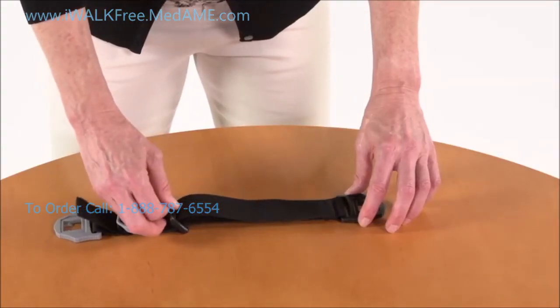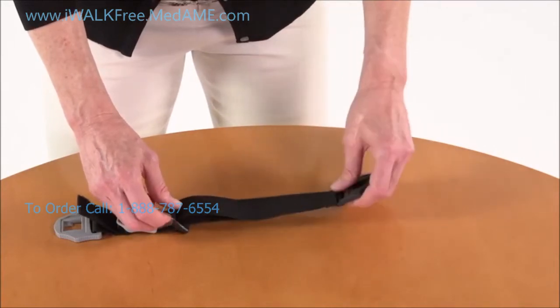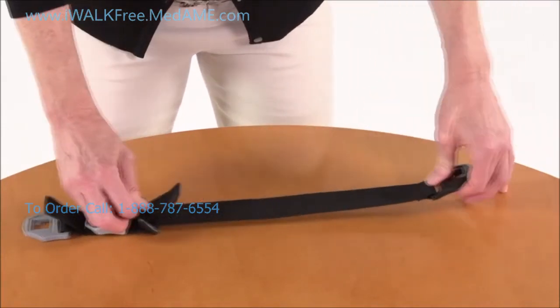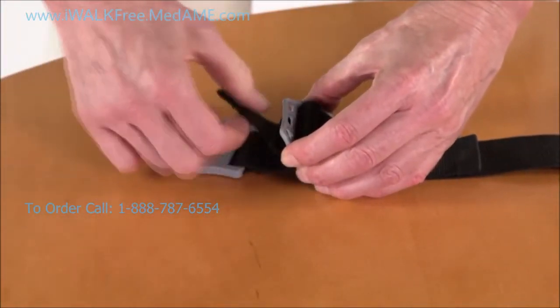Let's start by fully extending the straps. First, extend the adjustment section by lifting up on the tension lock while pulling on the T-lock buckle. Next, extend the donning and doffing section the same way.